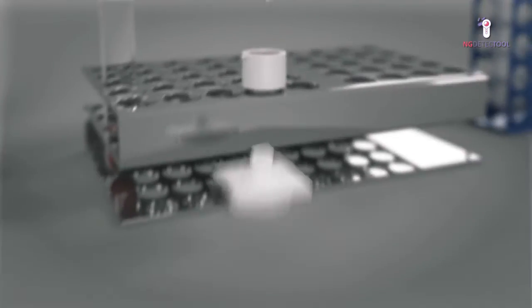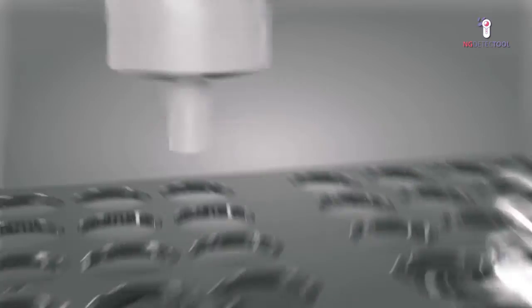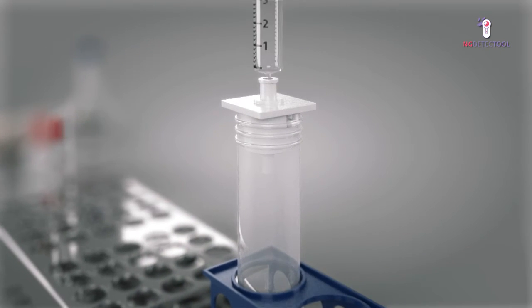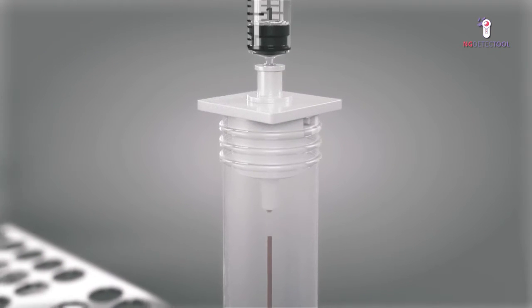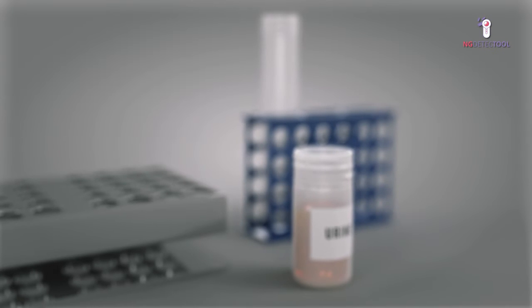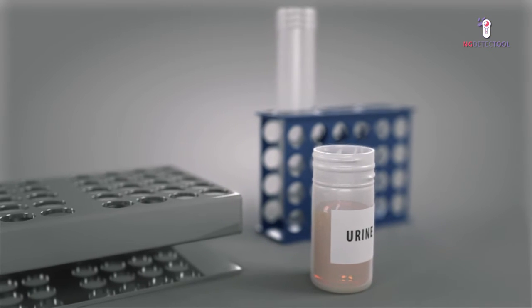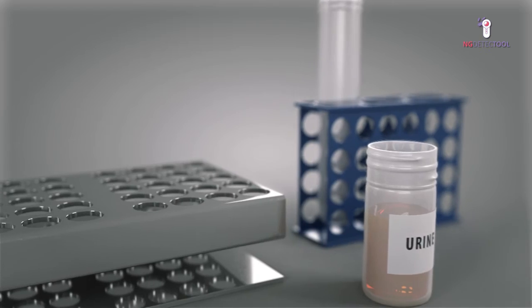Close the filtration system with the upper part and push the sample through the filter using a syringe full of air until bubbles appear. When working with a positive urine sample, the test is performed directly from the primary sample.